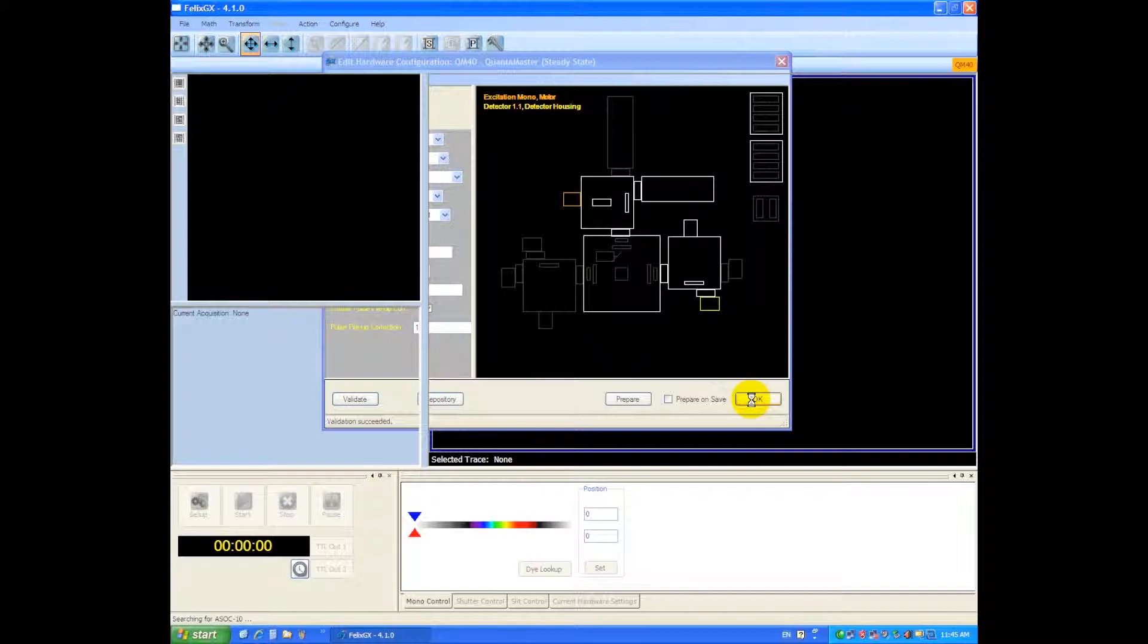Depending on your instrument, initialization can take anywhere from 10 seconds to 20 seconds depending on the number of motors and motorized slits and the various accessories that you have attached.